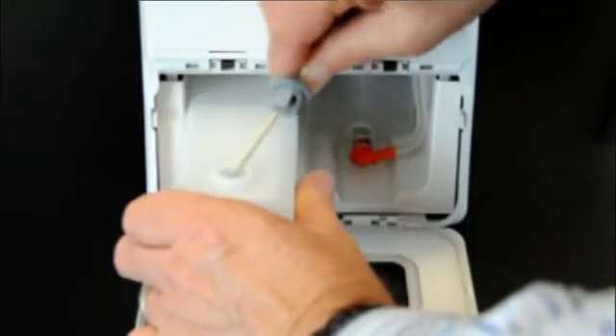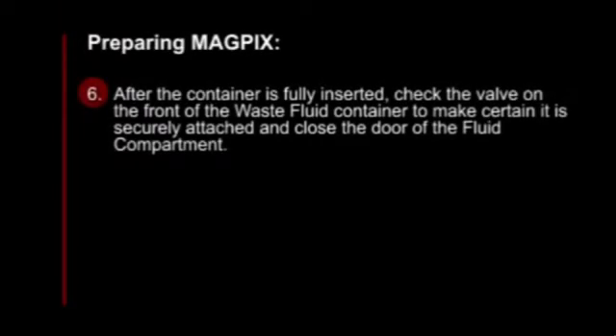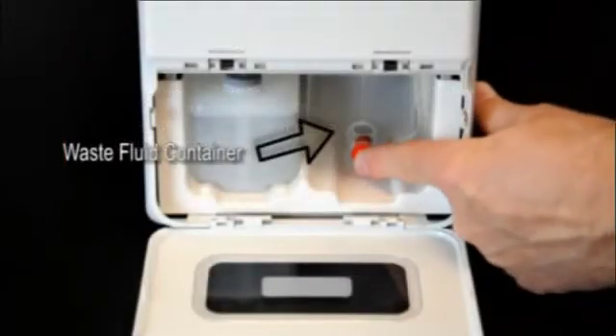Slide the container into the tray on the left side of the fluid compartment. The container tray is constructed to hold the container in place. After the container is fully inserted, check the valve on the front of the waste fluid container to make sure it is securely attached and close the door of the fluid compartment.